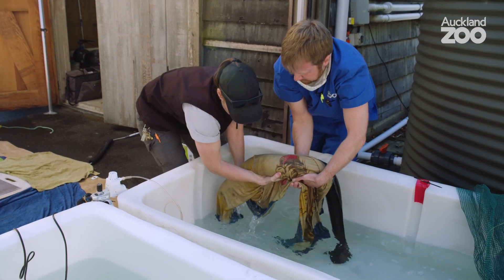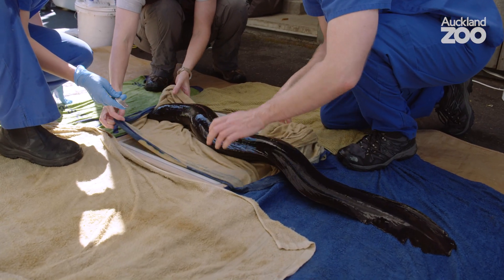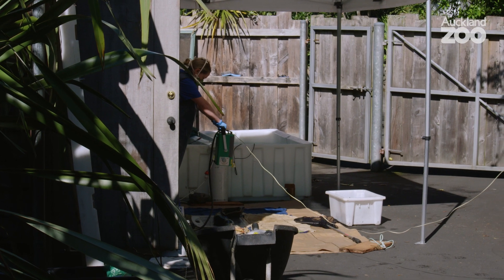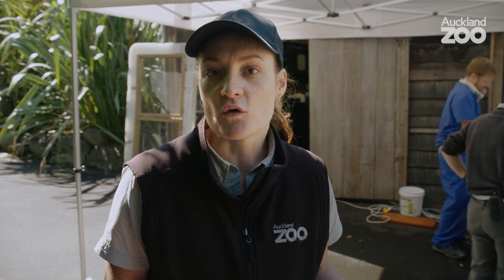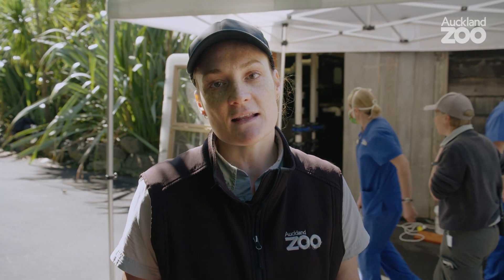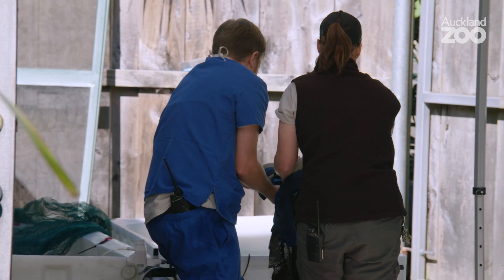I'm going to try and cradle the back end. It's very rare for us to x-ray anything that lives in the water — how do we get it to stay still while keeping it healthy enough to get good images? It took a little bit of planning, but luckily longfin eels have the ability to be out of the water for periods of time as an adaptation they have, so it's a little bit easier to do this with the longfin eel than some other species.